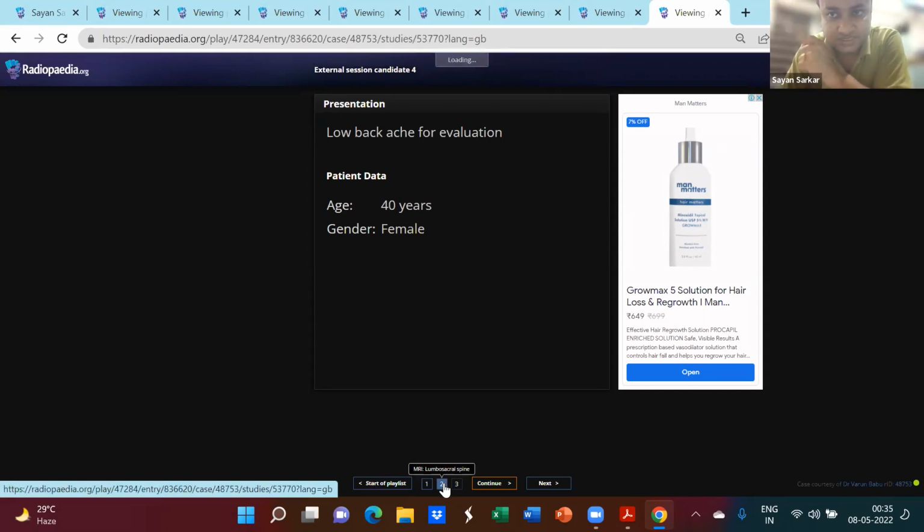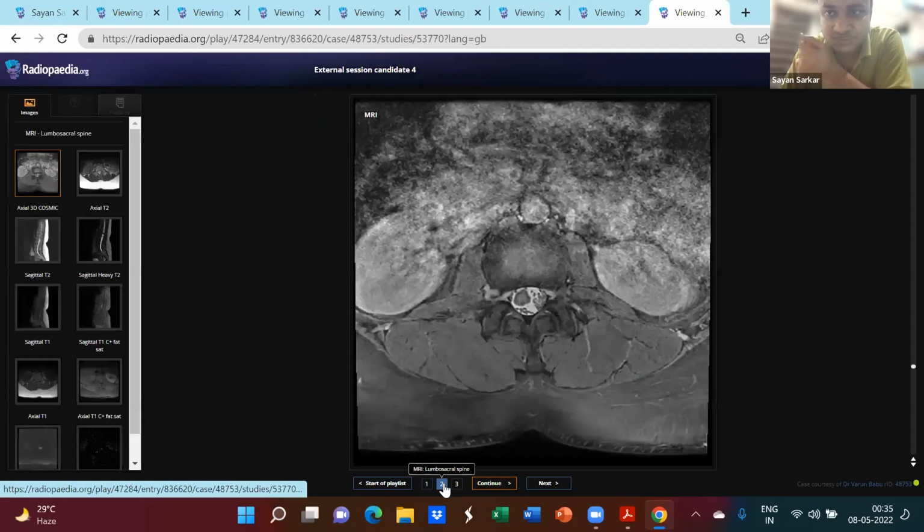This was your last case, rather your first case. So this was fine. This was just a schwannoma. All I wanted you to tell was the neurogenic tumors, what are the possible differentials, what are the systemic manifestations, syndromic associations and all. You told fine, this can be NF2. NF2, you have to tell about family history and management. Those things are fine. And not much to say on this, I suppose.